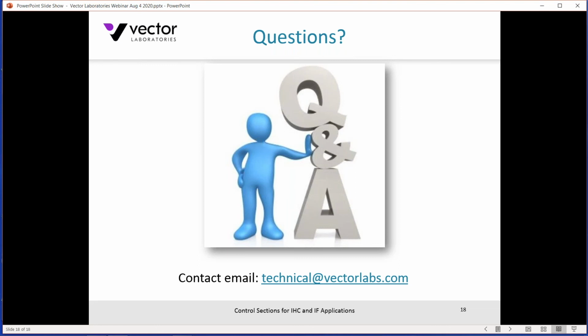Brings me to another point in that if the two primary antibodies are mouse, if you're using two anti-mouse detection reagents, that's going to be problematic. So in that scenario, it'd be highly recommended to avoid that. Use a mouse and a rabbit primary antibody, or a rabbit and a goat, or a mouse and a goat, something like that, where that potential of cross-reactivity between the detection systems is eliminated.